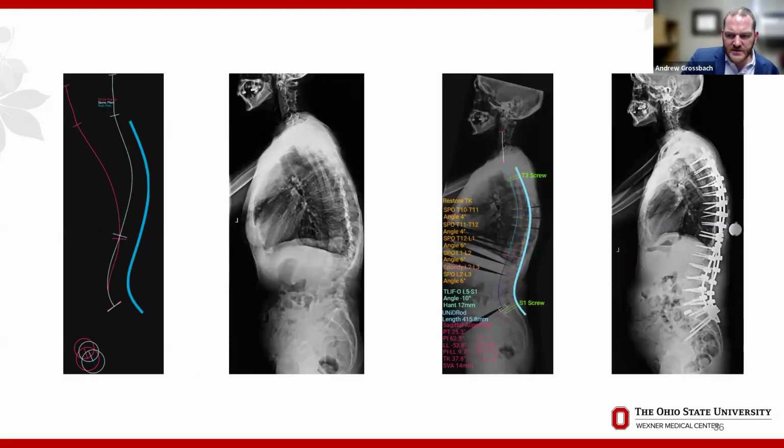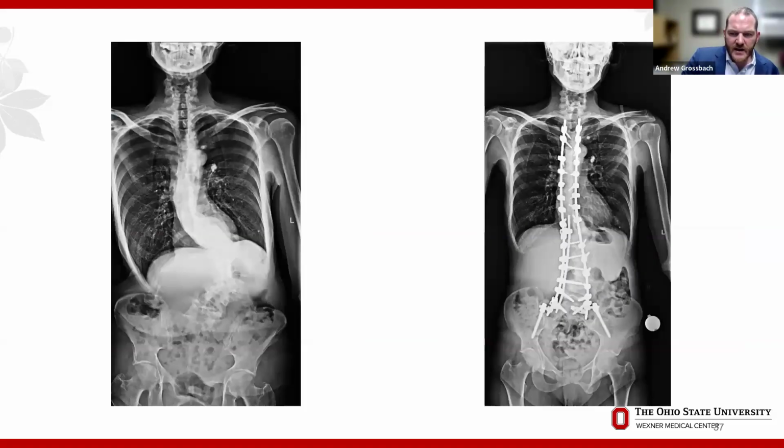And so this is her post-op X-rays after, and so able to get again a lot of osteotomies to correct this coronal deformity, but we can really dial in where we want that lordosis correction, where we want to maintain our normal lordosis and not get hyperlordosis laying on an open Jackson frame and really have them sink down into the bed with a lot of posterior column work.